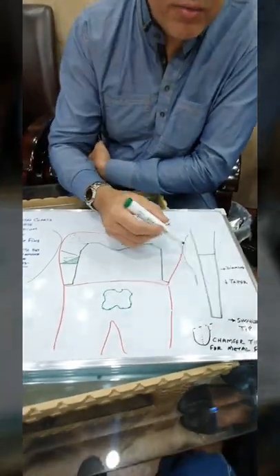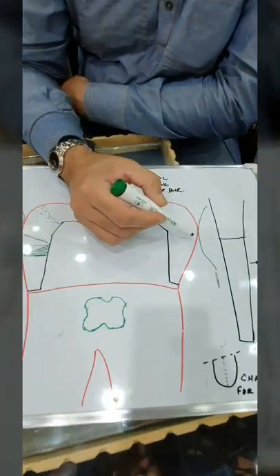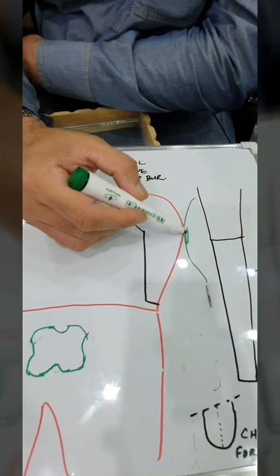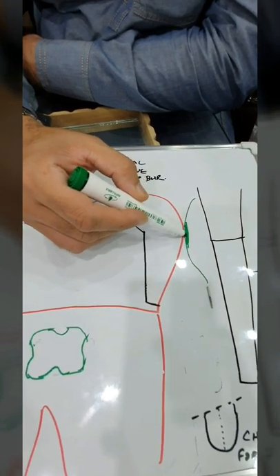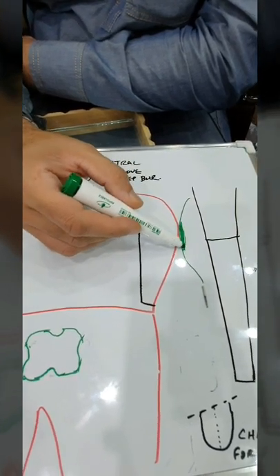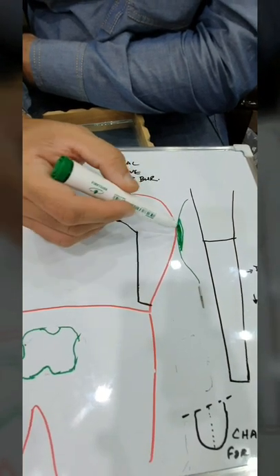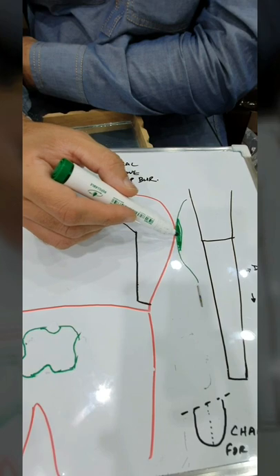One of the worst things that happens, and I see that happen in the boards or examination, is when you're prepping the margin interproximally, you end up nicking or cutting the adjacent tooth. Now that's an automatic failure for all the boards that I do know, or all the bench exams everywhere. And even clinically, you do not want to end up cutting the adjacent tooth.